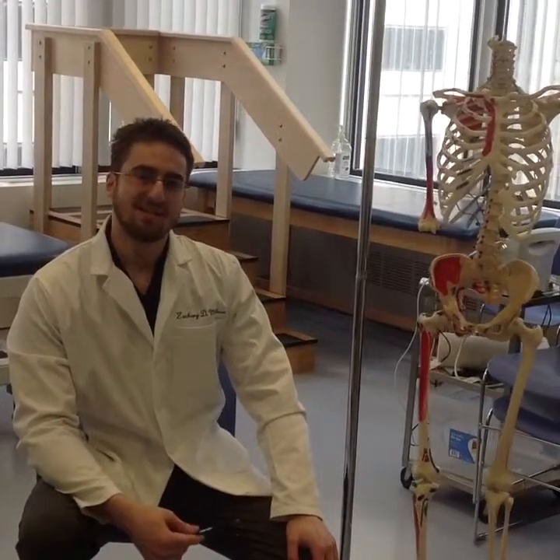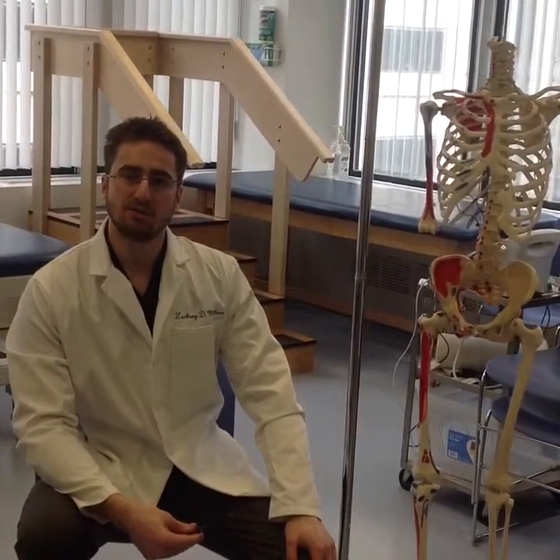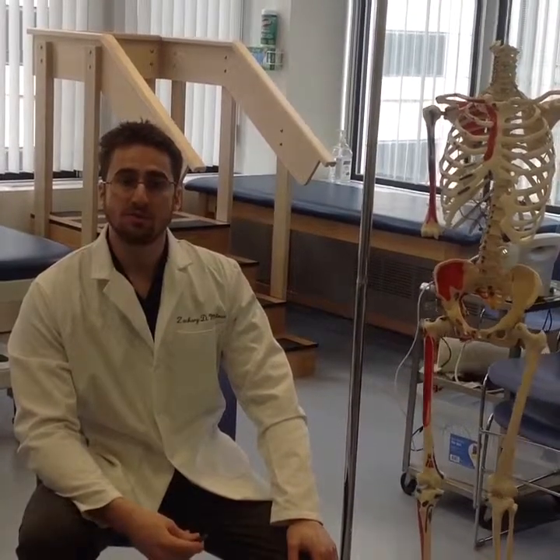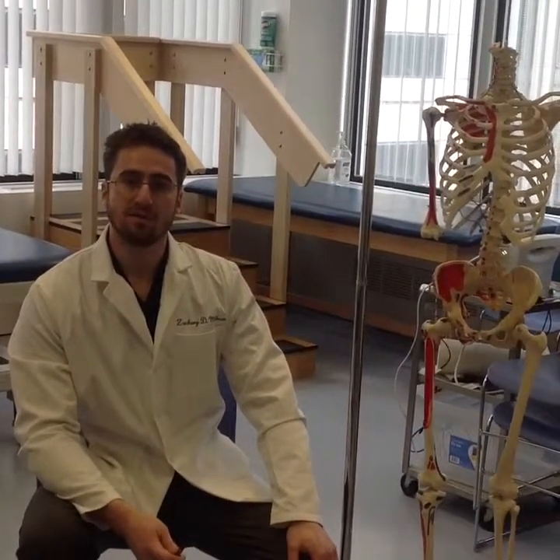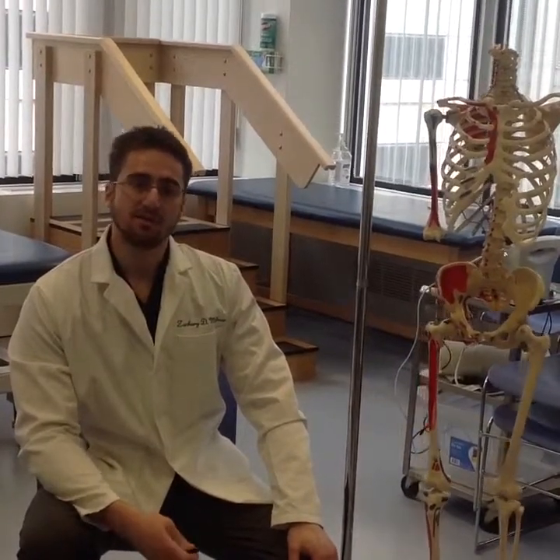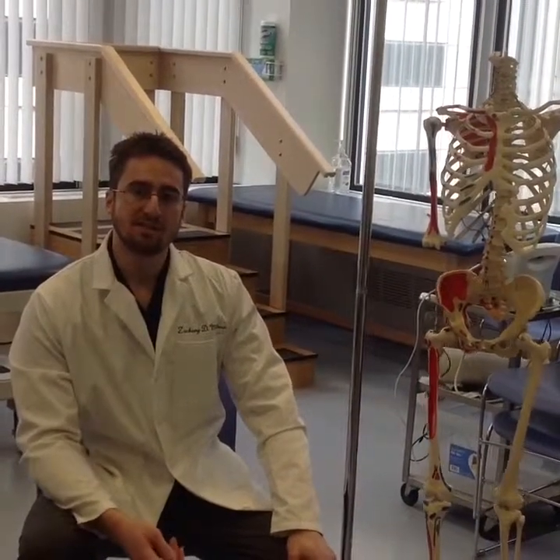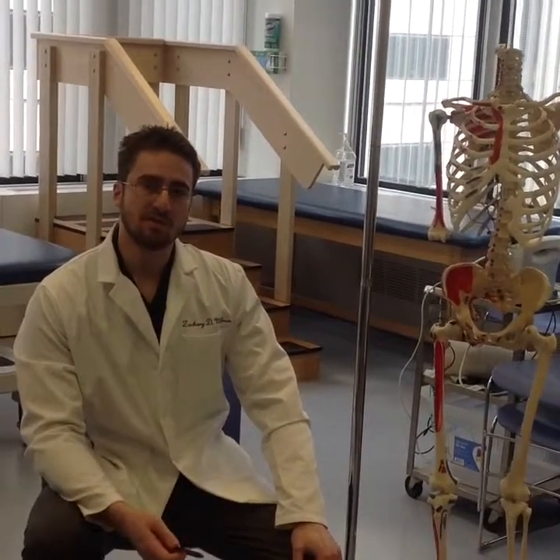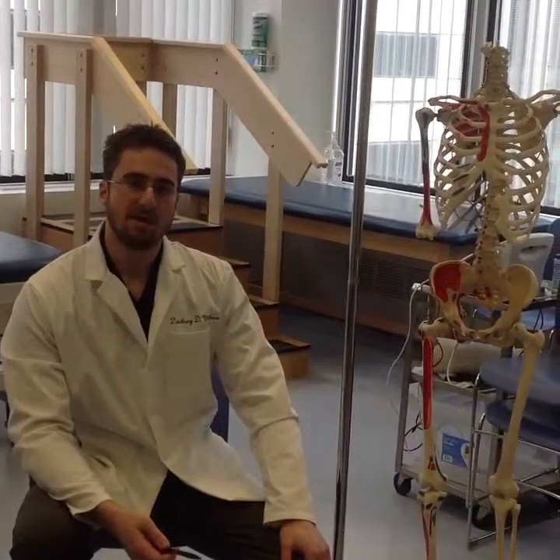The test is indicated whenever we want to measure initial range of motion, measure progress throughout the course of therapy, and also to compare both sides. We're going to go into the tests in a little bit, but first we're going to explain a little bit of the biomechanics.